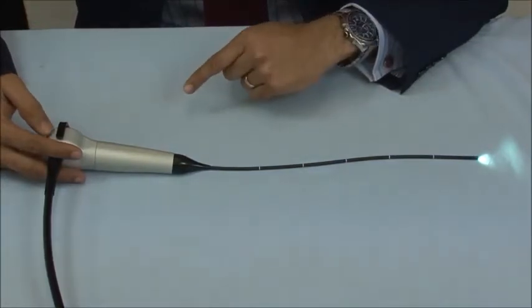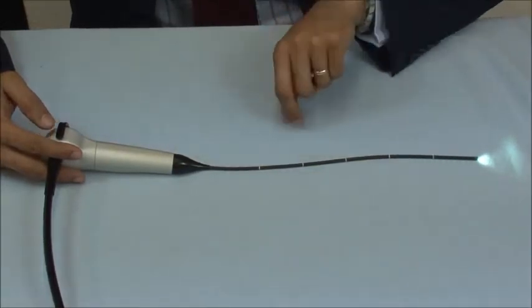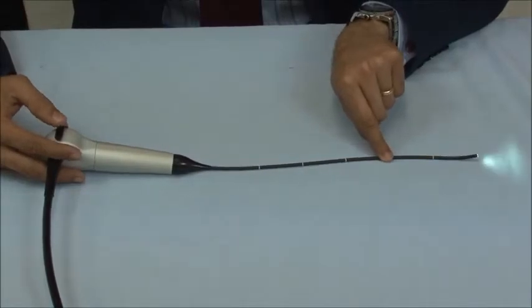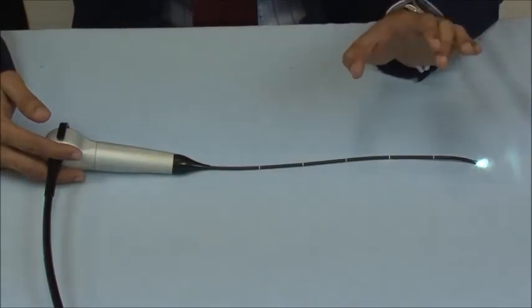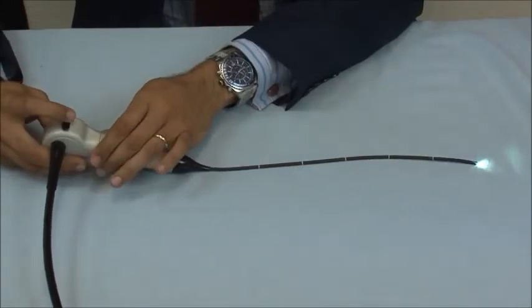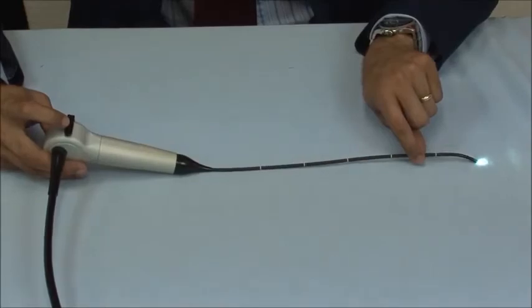They all have a control like that, which controls the tip. And some people prefer to use the thumb. So if you move it, the tip comes up or it goes down. And that's to help you guide the scope as you enter the nasal cavity and start looking into the larynx and pharynx. Some people do prefer to use the index finger, again, to do the same thing. Up, down.